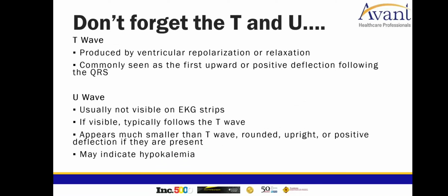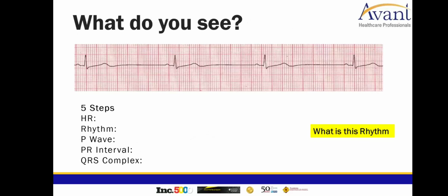I mean, they're not going to be used for the interpretation, but just as a side note, remember what the T wave represents, and I already mentioned the possibility of looking at hyperkalemia or hypokalemia, but those are things that we look at. Okay, so are we ready to start and add all this information to our very first strip? Let's take a look. This first strip, what do you see?